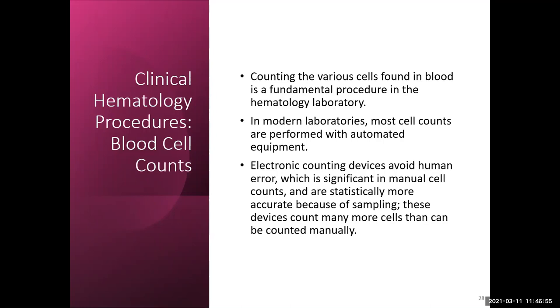But of course, there are situations where things can interfere, so the counts aren't always accurate. That's where it's going to be your job to learn how to recognize those things and learn how to report out an accurate result based on other criteria.